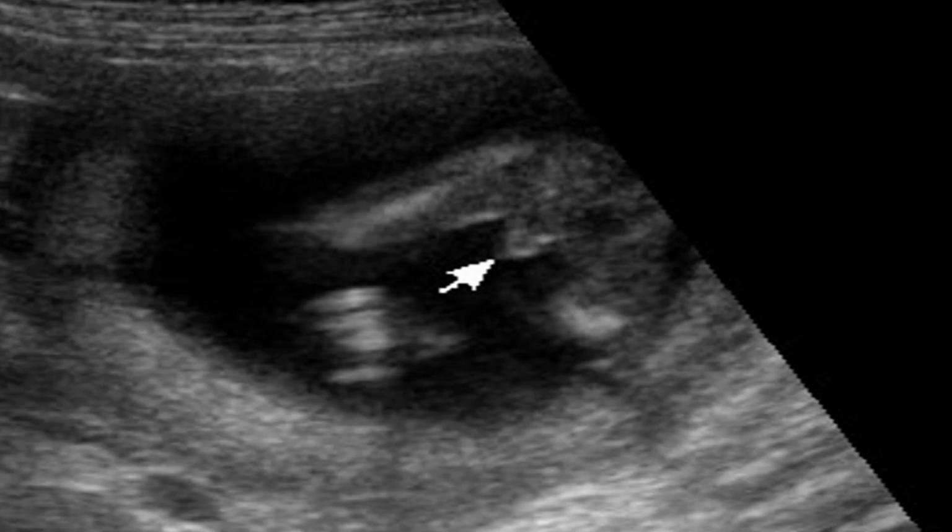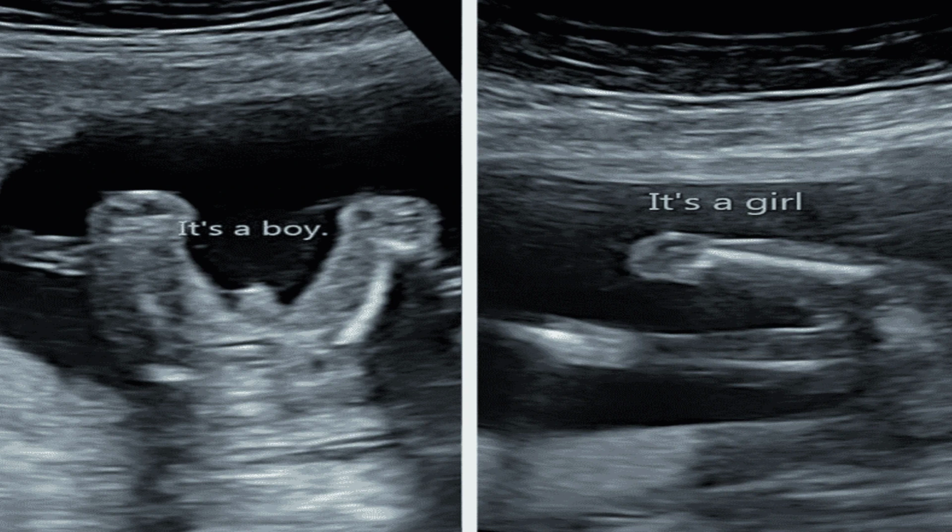This one is a bit tricky. In this picture, we don't really see one of the legs, and this can be because that leg is bent due to normal movements that are happening inside. And you guessed it right, this is a baby boy because we can see the little penis. And this one, yes, you're right again. This one is a baby girl. And lastly, this picture is just to see the difference and finalize things up.